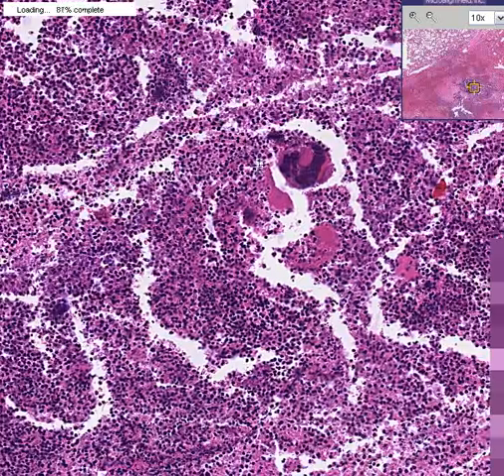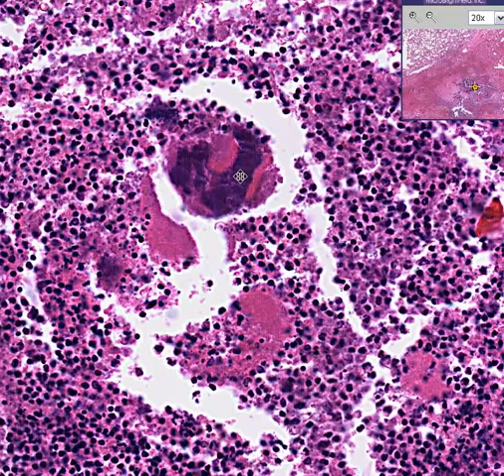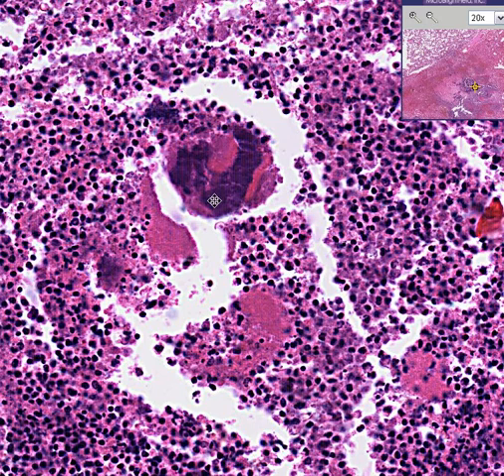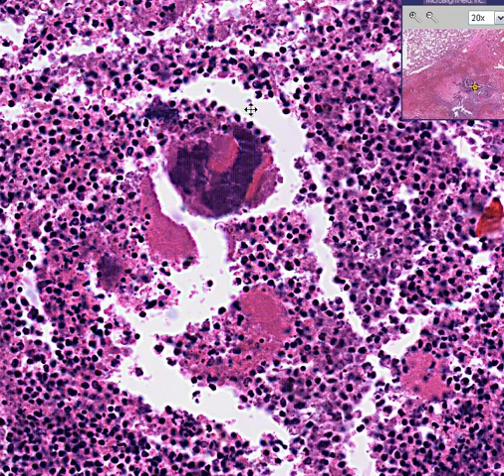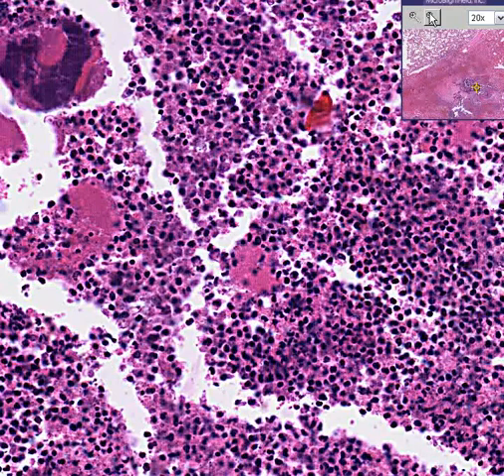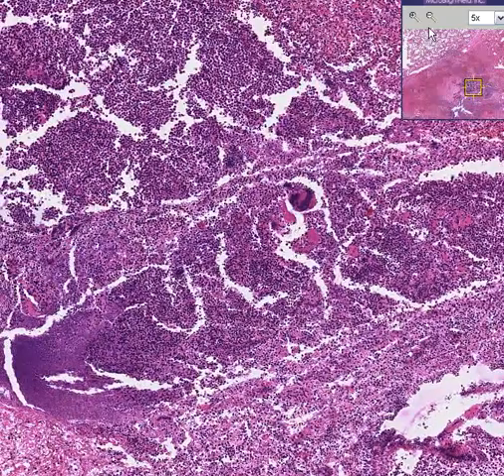Within the abscessed areas you can see other areas that look extremely blue and extremely granular, like when we saw that cluster of bacteria on the pericardium. Appearances like this often represent gram-positive bacteria, although we are not at enough resolution to really show a coccus clearly. If we had an oil lens at perhaps 100 power rather than the 20 shown here, we could be more certain. So this is a pulmonary infarct — you could call it a septic infarct because bacteria are visible as well.